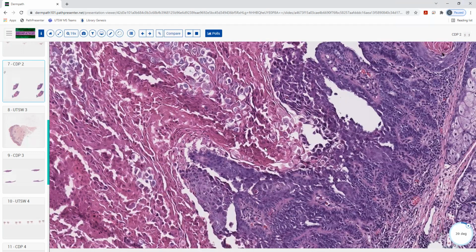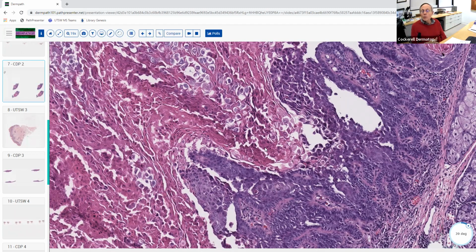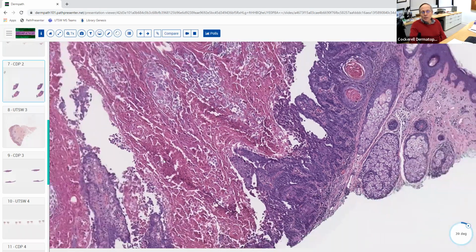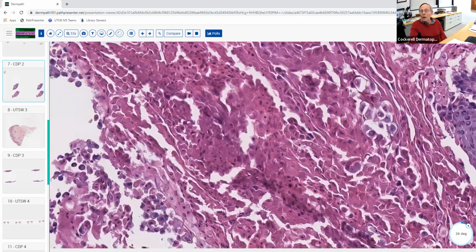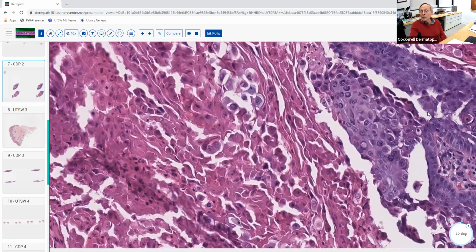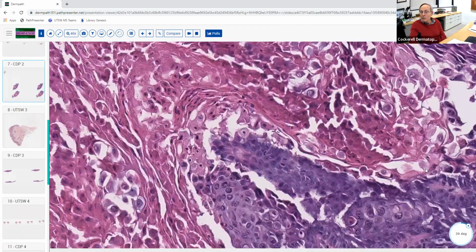And again, same concept. You get a lot of different diseases, about 5 or 6 different diseases where you can see this change, like Grover's disease, sometimes you can see it in Darier's, obviously, which is the classic example of it. You can get that in epidermal nevi also, post-zygotic mutation, same concept. So there's about 5 or 6 conditions where you can see this reaction pattern. So this is different. You can see how different this looks in the last one.